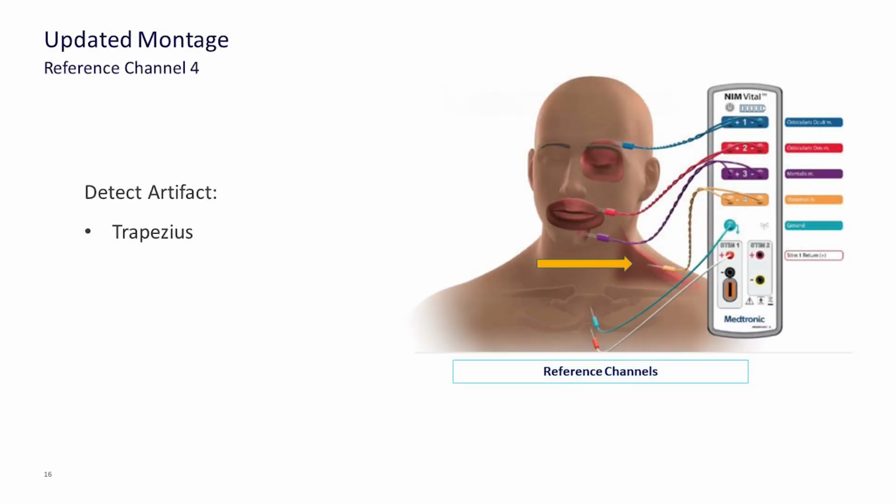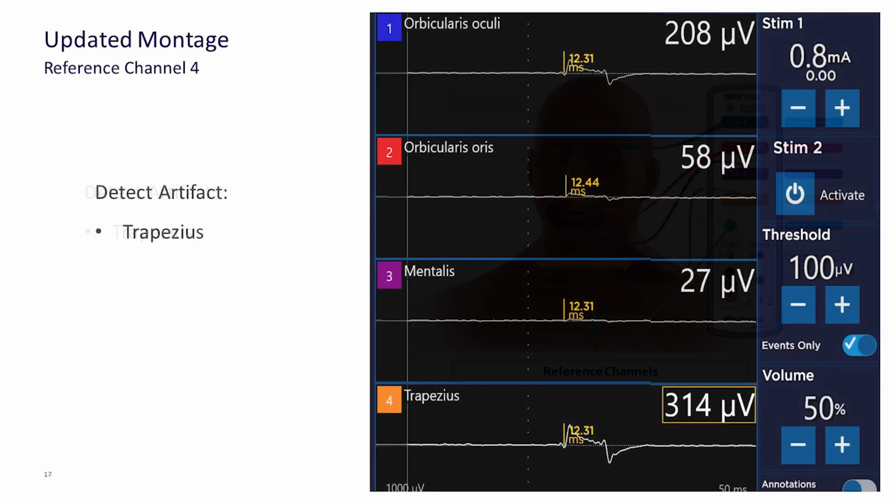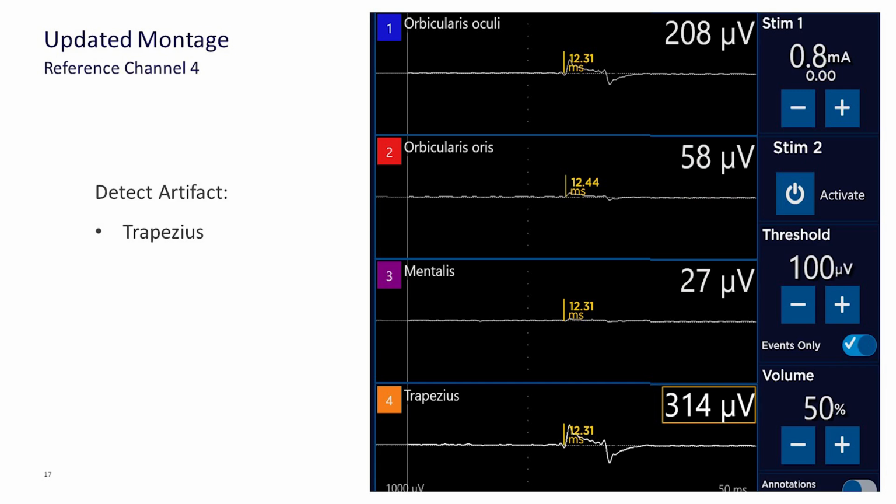Therefore, while channel 3 is used to increase sensitivity, we use channel 4 to help detect artifact. We refer to this as the reference or control channel. There are many muscles that could serve this purpose, but for facial nerve monitoring, trapezius is most practical. Here is an example provided from our best practices in facial nerve monitoring.